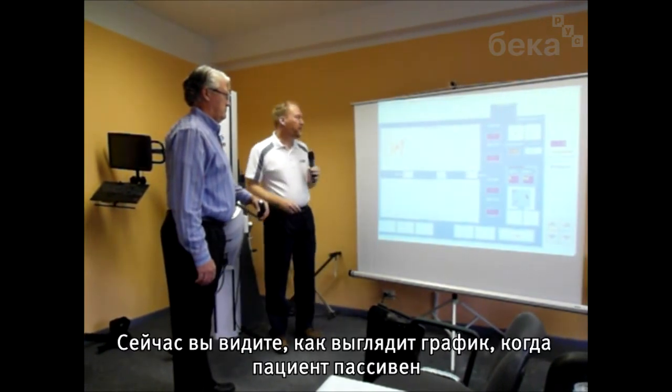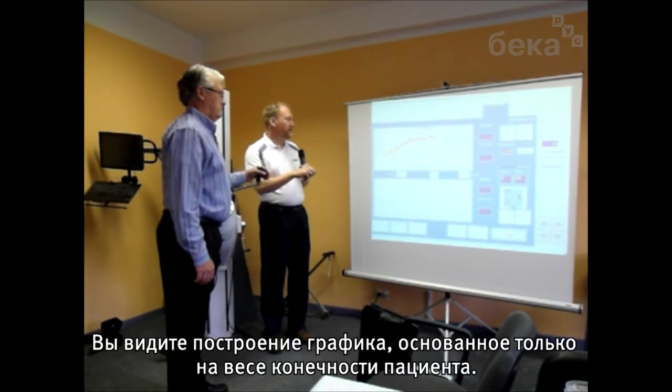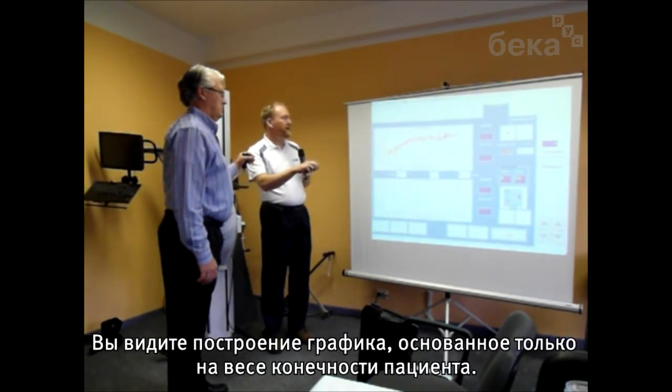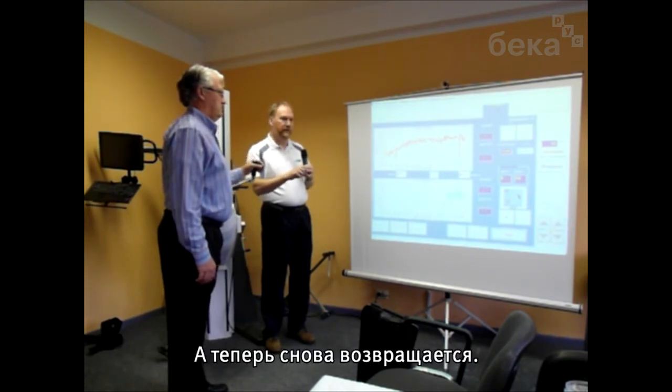So this would be the graph as it looks if the person's being passive. You just see a build up to the point of the weight of the limb. It stops, and then it comes back down again.